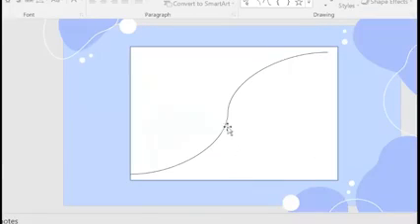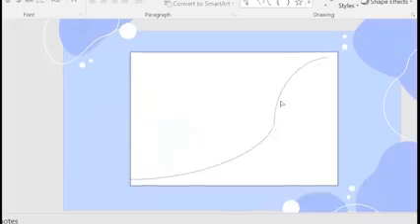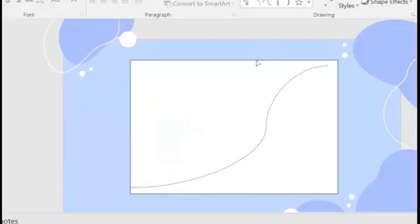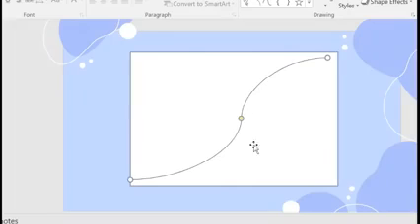Okay, so if this is your characteristic curve, for example, if you make it steep, if you increase the steepness of the curve, that means you are adjusting the contrast. Okay, but if you're moving it from left to right, you are adjusting its brightness. Okay, so basta pag steep na siya, you're making it steep, you are adjusting the contrast.